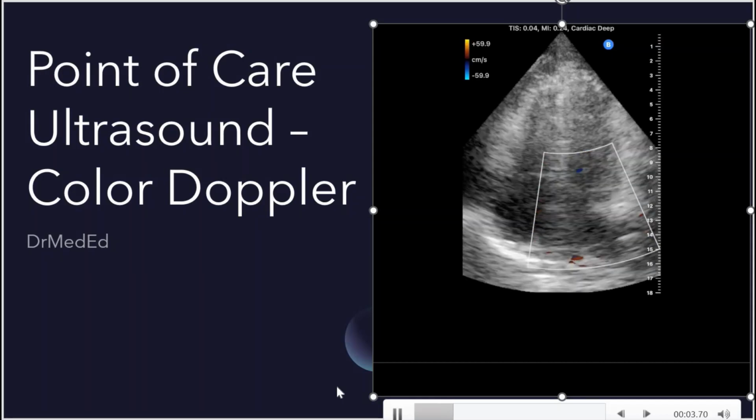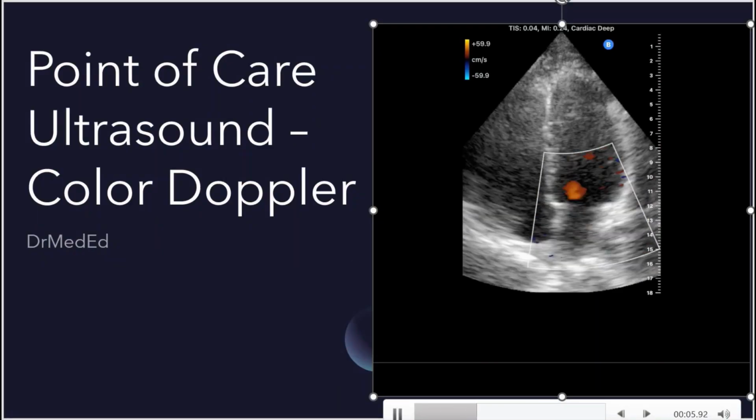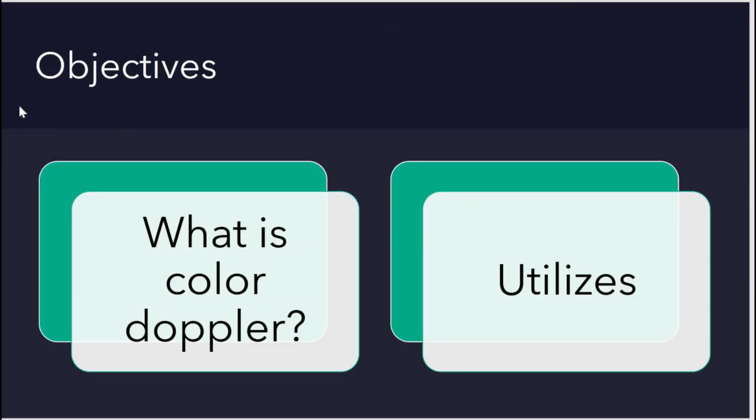Today we'll talk about point-of-care ultrasound color Doppler. Our objectives are: what is color Doppler and what do we use it for?